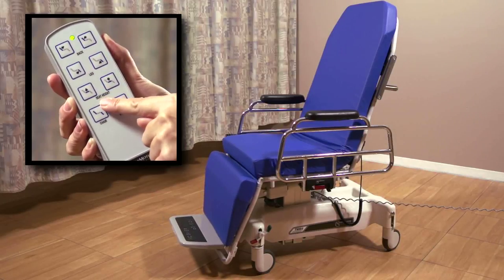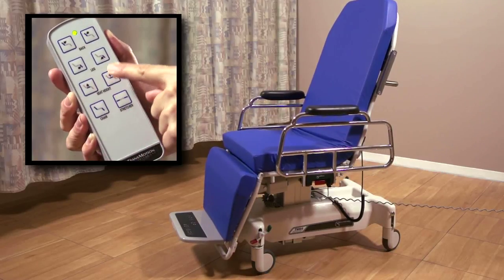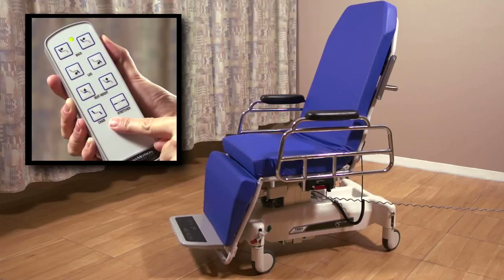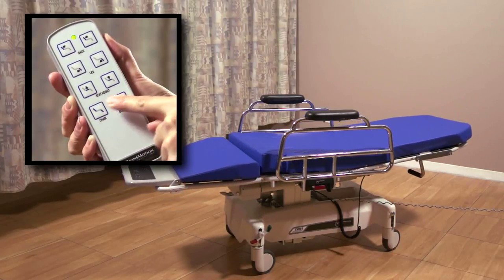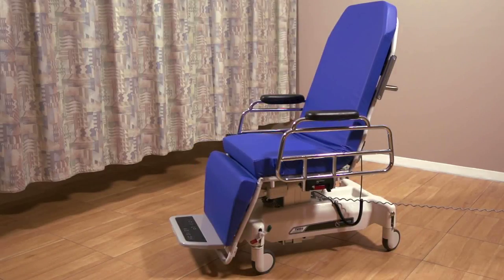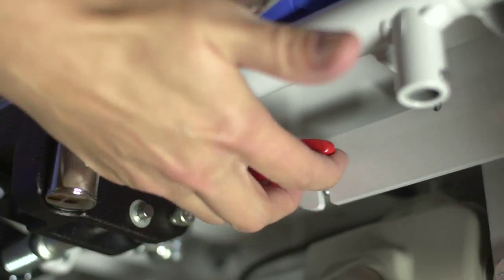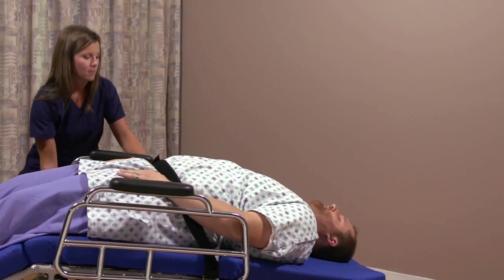The next row of buttons controls the height. The left button raises the seat and the right button lowers it. The auto-contour buttons simultaneously move the back and leg sections, letting you put the chair into a flat, reclining, or a fully upright sitting position. The chair is also equipped with a manual quick-release located on the patient's right side, which will quickly lower the back section of the chair in the event you need to perform emergency CPR.